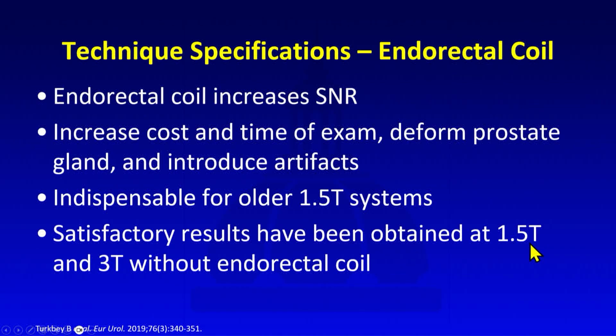What about endorectal coil? So many years ago when I was a fellow, that was one of the jobs of the fellows, to put in the endorectal coil. And when the technologists would come in, then we would all look very busy, so hopefully someone else gets to do it. But then we stopped doing endorectal coils many years ago because, again, with the newer systems, the image quality is quite good even without the coil. But if you are using an old machine, then you may need that endorectal coil just to get enough signal.